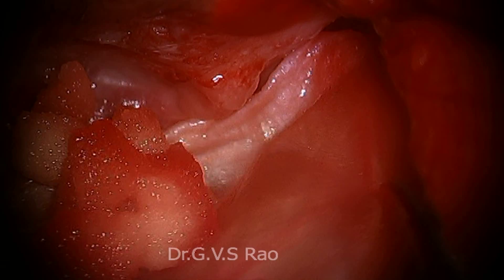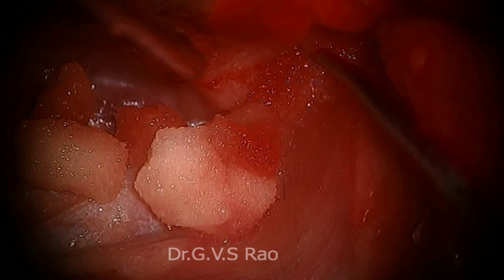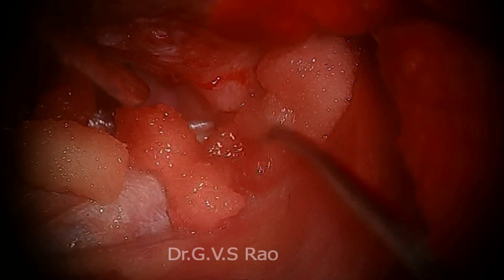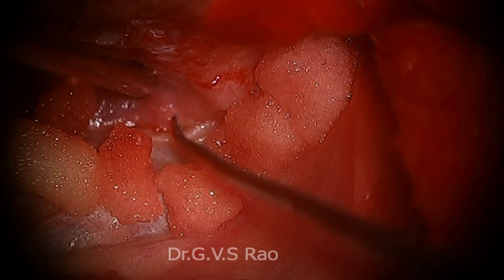Covered. Now I want to keep the gel foam there. Here also — see, like this, like this. And you know we remove so much cartilage and we can't get anything extra than this cartilage for this type of surgery.